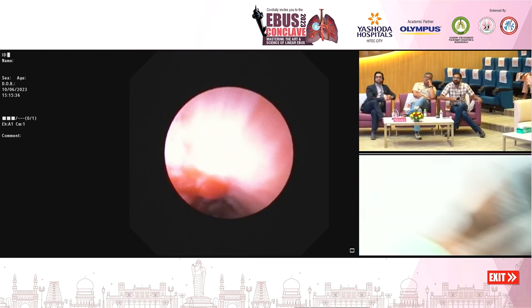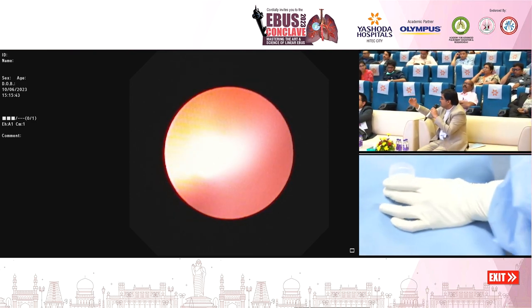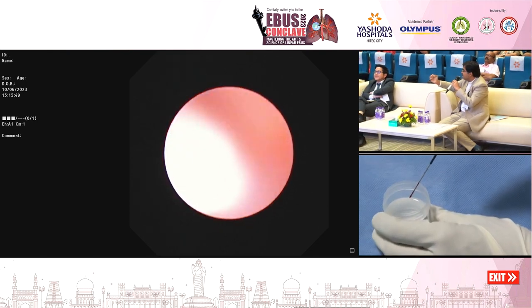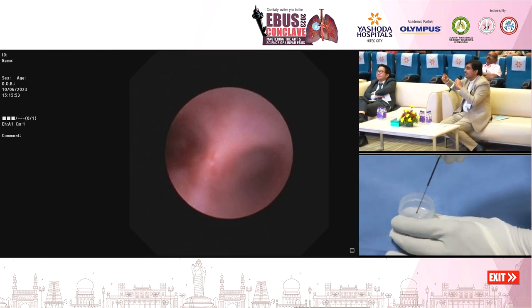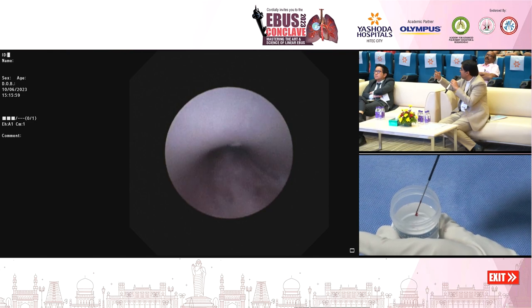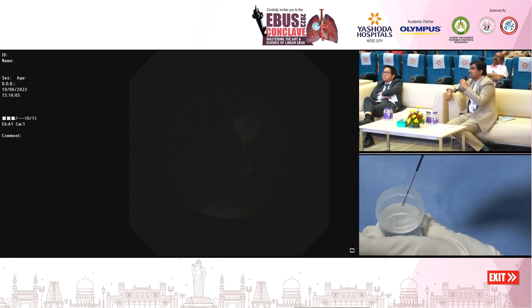So now there are three techniques. One is the normal conventional technique. Second is the fanning technique, where every time you pull the needle a little bit out, you slightly change the angulation, then go in. So that's called the fanning technique. And the technique which has been demonstrated is the slow capillary pullback technique, where you don't apply suction actually. You only slightly withdraw the stylet, and as you withdraw the stylet, you do the revolutions.